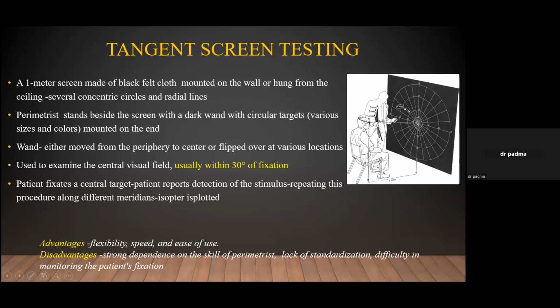And this is the tangent perimetry, which is not commonly used these days. For want of time, I'll just tell the disadvantages: strong dependence on the skill and technique of the perimetrist, lack of standardization, difficulty to monitor patient fixation, and the lack of normative values.